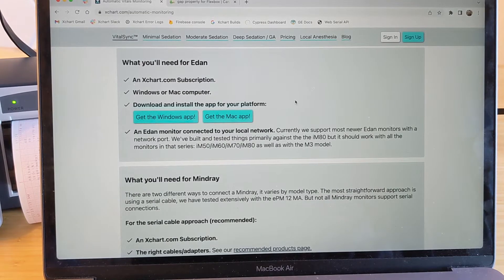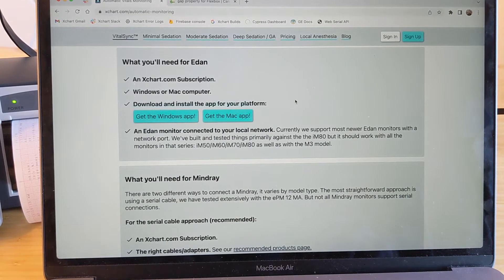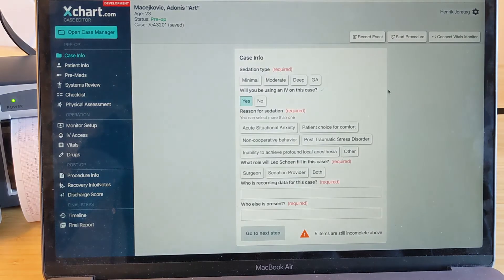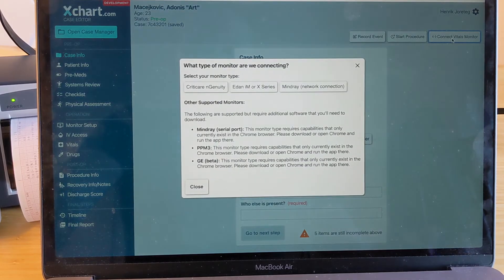So we have both Windows and Mac app options. I have the Mac app installed here already. And at this point, we're here in a case. And all we have to do is hit connect vitals monitor.